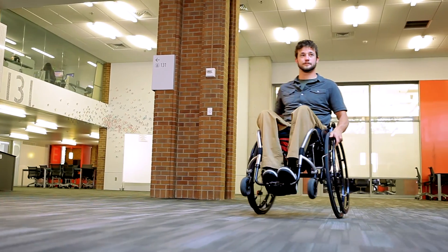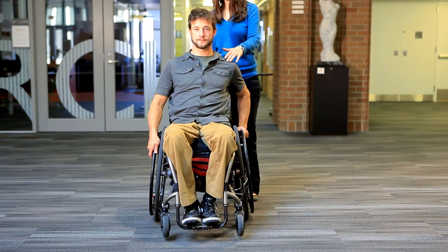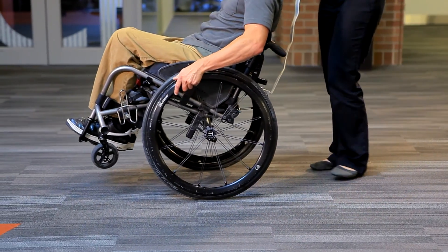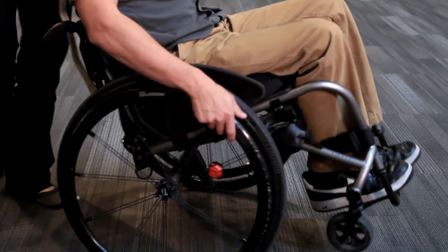After you have control of your balance and speed with that method, you can learn how to turn more tightly and efficiently. Begin again in a wheelie, but this time pull back on one hand rim while you simultaneously push forward on the opposite hand rim.